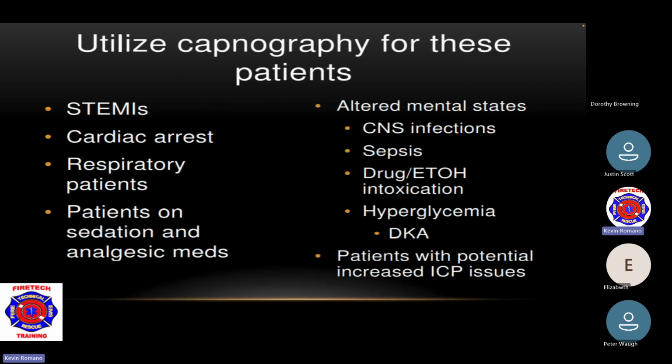These patients should be STEMIs, cardiac arrest, respiratory patients, patients on sedation and analgesic medications, altered mental status, CNS infections, sepsis, drug or ethanol intoxication, hyperglycemic patients like DKA, right? Or patients with potential increased ICP issues.